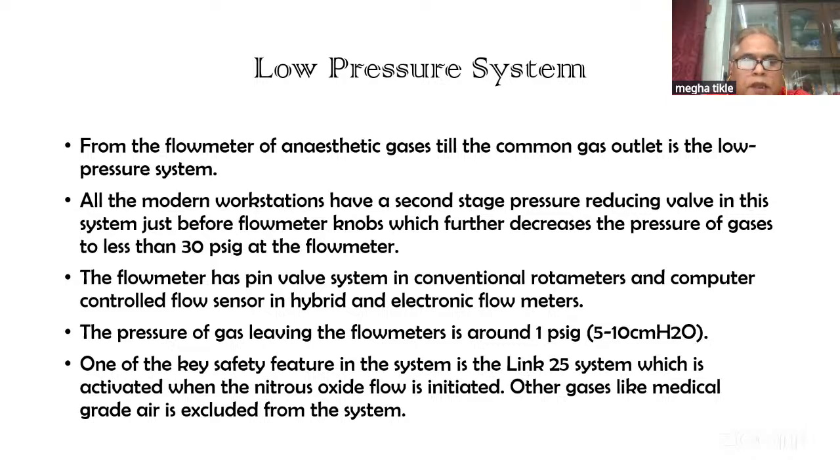and given to the patient. Now, one of the key safety features in this system is the link 25, which is activated when nitrous oxide flow is initiated. Other gases are not linked to the system, so their operations are independent of the link 25.